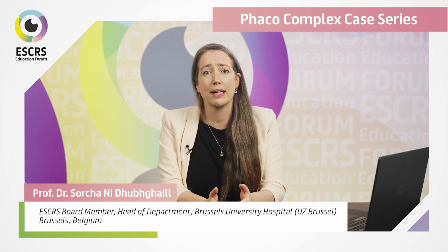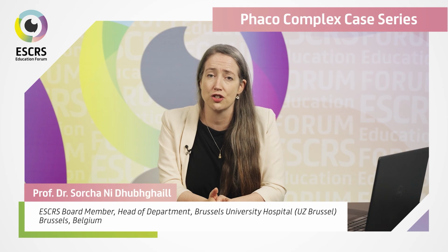Hello, my name is Professor Sorcha Ní Dhubhghaill, and in this video we'll explore how we tackled a complex case and successfully performed an IOL exchange in a tricky situation.